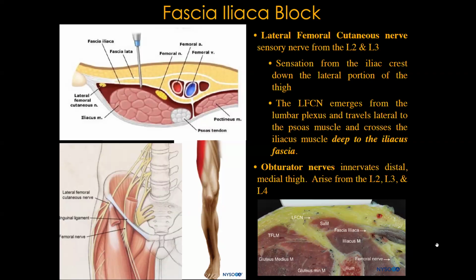So your needle's going to pierce that fascia iliaca, and you're going to feel it just like you feel the ligamentum flavum when you go through with an epidural needle. You're going to feel a pop. And then you don't want to be intramuscular, but you also want to make sure you're through that fascia. So that's the key distinction. You're in a potential space. Most of the blocks we do are in a potential fascia, and that will open up with spread.